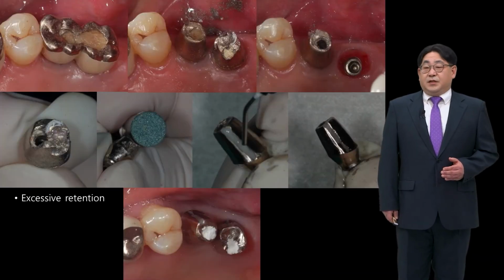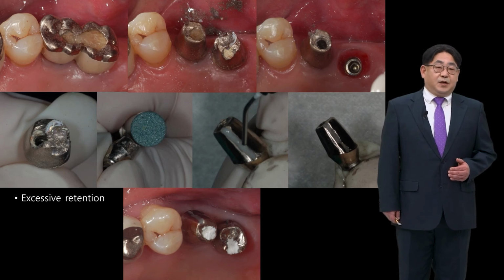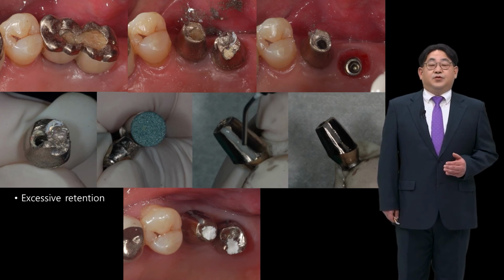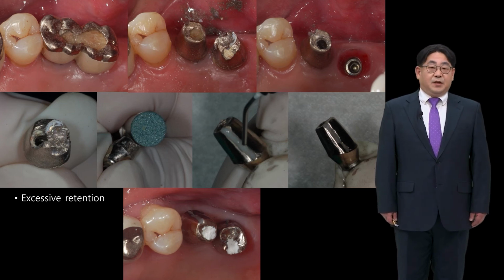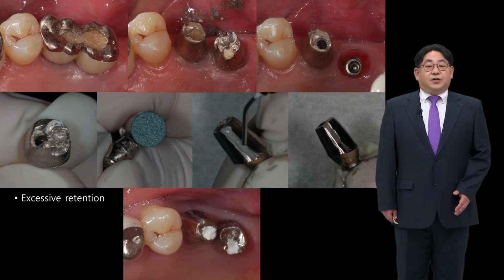As shown in this image, if the screw is loose, but you cannot find a screw access hole no matter how many holes you make, in this case, you need to remove the prosthesis and adjust the abutment to reduce retention and form a new restoration. In terms of retention control, a screw-retained prosthesis is much more favorable.